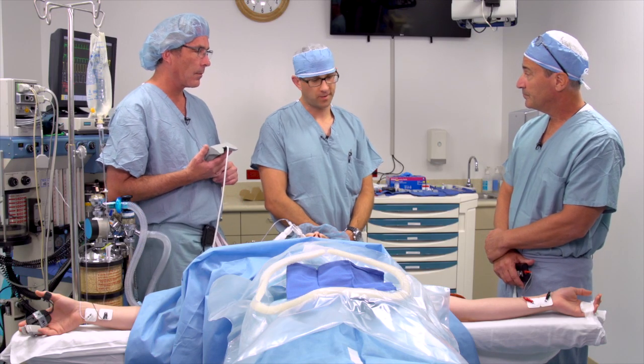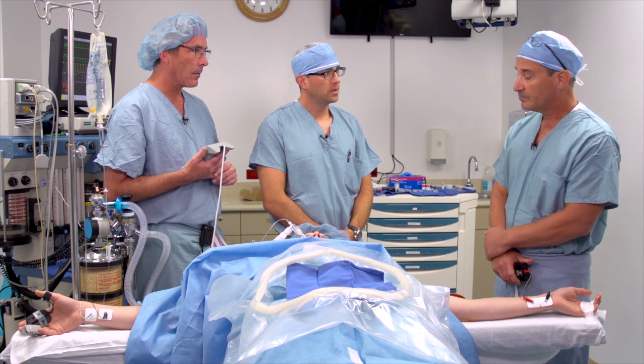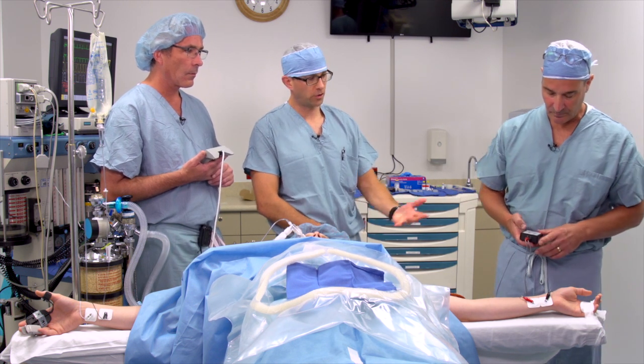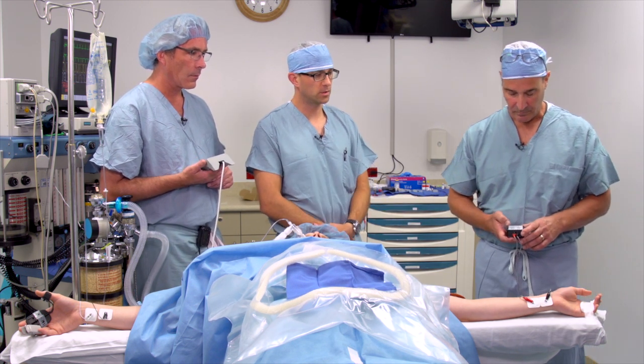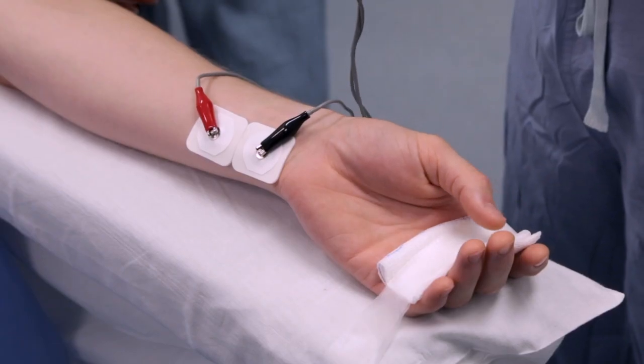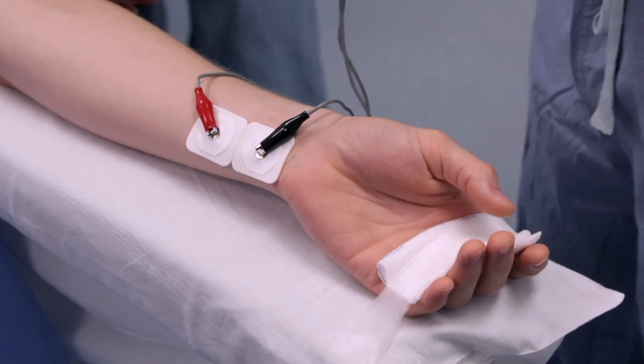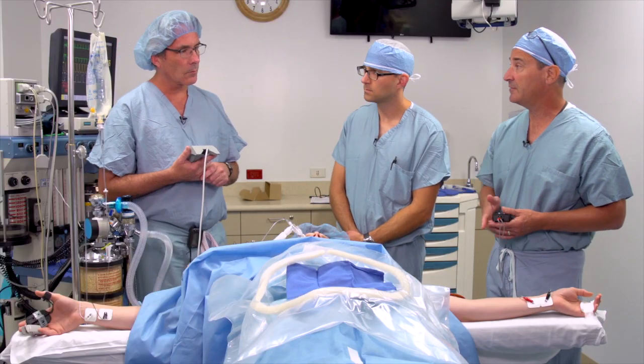Some time has elapsed and we're back after our neostigmine reversal to check twitches with our qualitative monitor. Twenty minutes has elapsed. We're going to do a train of four — we're hoping to have four out of four count without visible fade. We have four twitches, no visible fade.